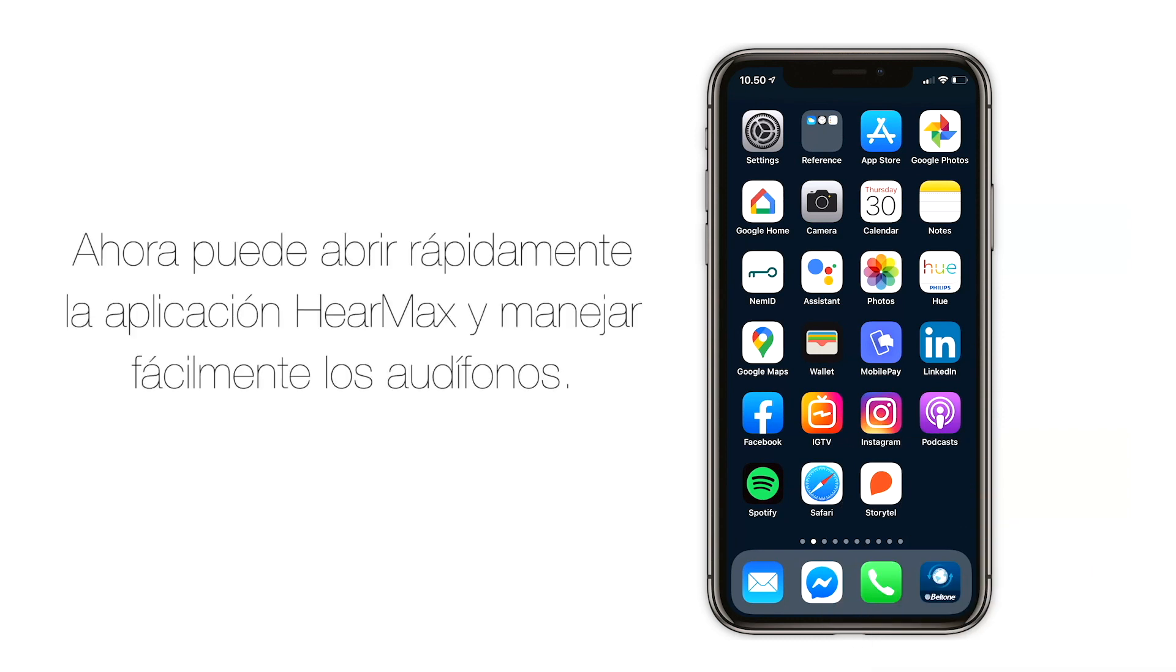You can now quickly open the Beltone HearMax app and easily operate your hearing aids.